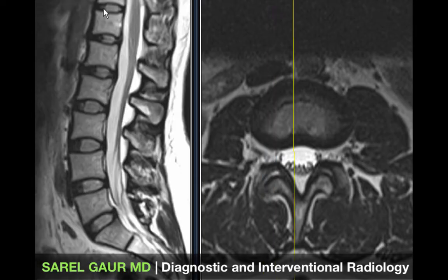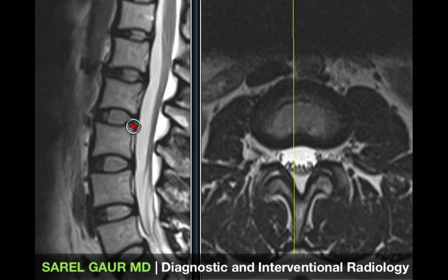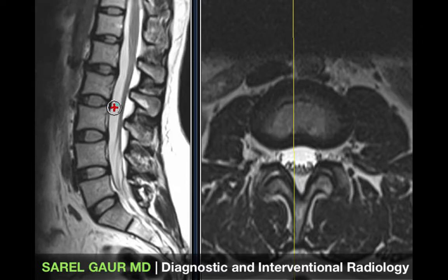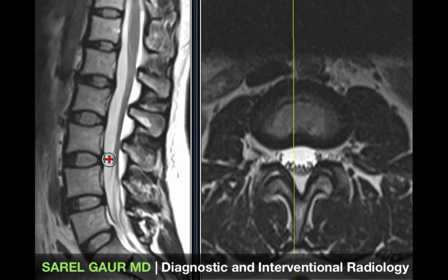Let's go back and talk about the vertebral column again. We have these vertebral bodies — there is low signal surrounding each vertebral body which is the cortex, the thick bone, and internally we have high signal due to the fat content and marrow of that vertebral body.